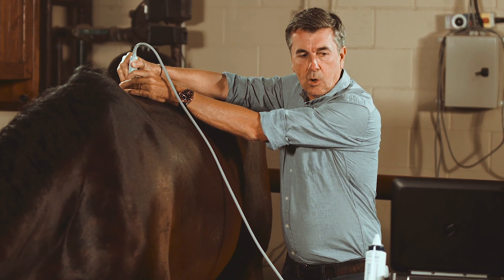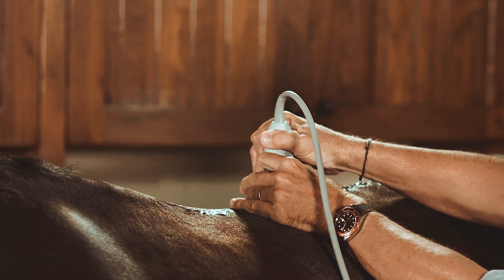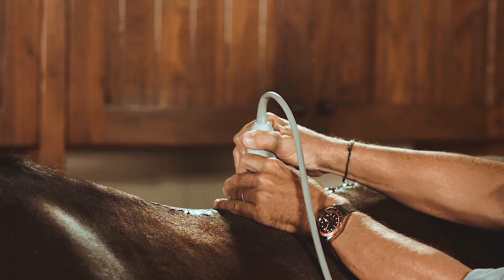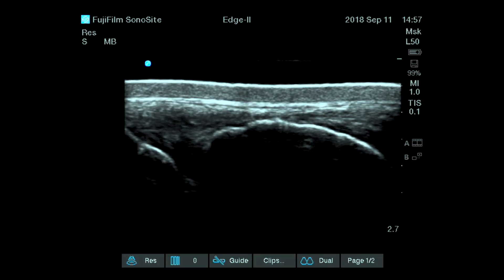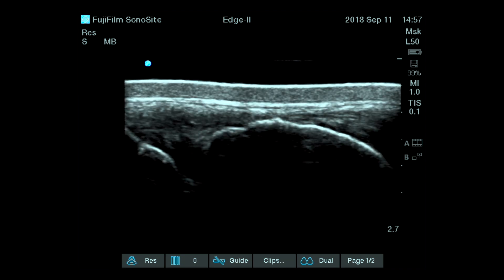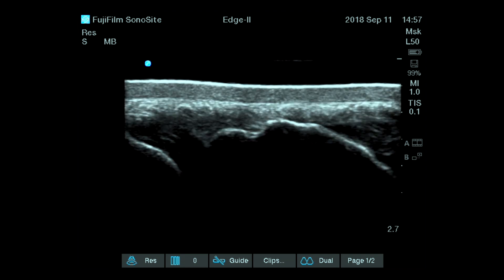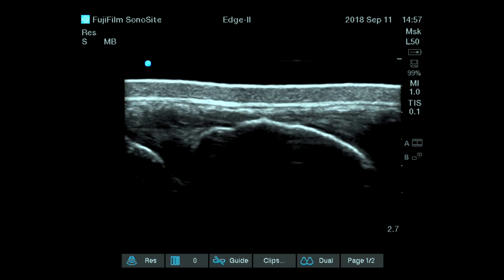You can go along the back all the way down, making sure that the distance between the skin and the spinous process is respected. Some spinous processes like this one might be irregular, either because you have some enthesopathy — as we see here on this horse — a small irregularity of the bone surface and some echogenic finding within the ligament.